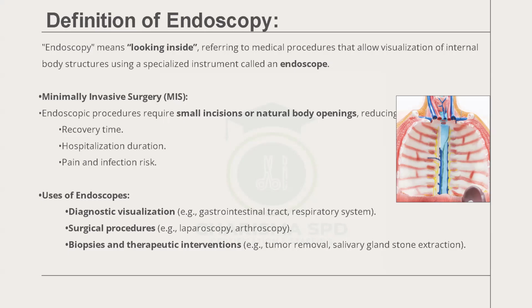They use the scope to see on the monitor or the TV. To make it easier for everybody, there's a TV that we call a monitor in the room, like your computer. The image of all your internal organs will be showing there, and the surgeon is working on it. They don't have to open you so big, which would take longer for you to heal.